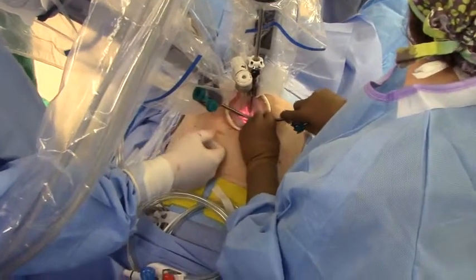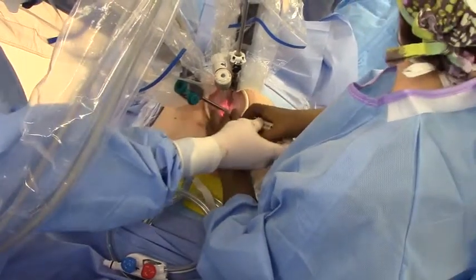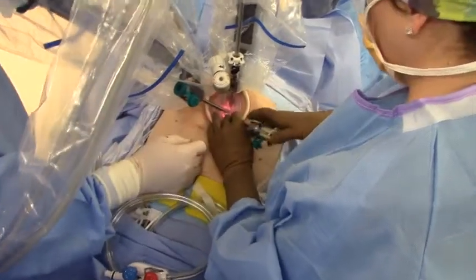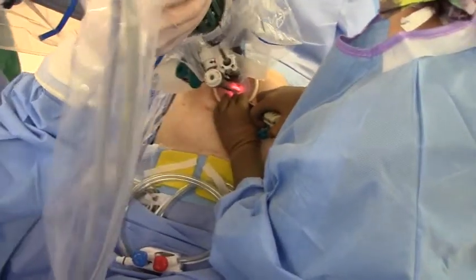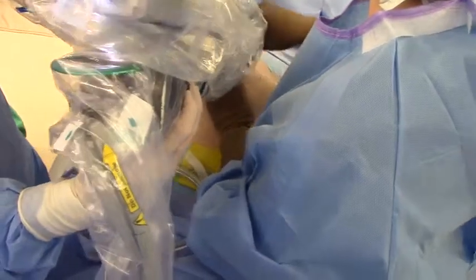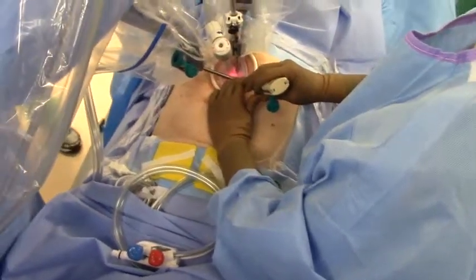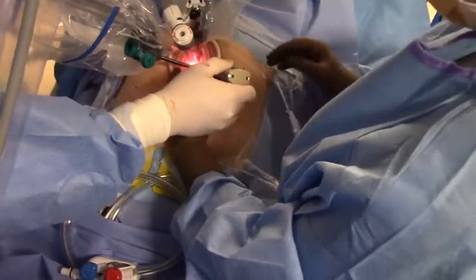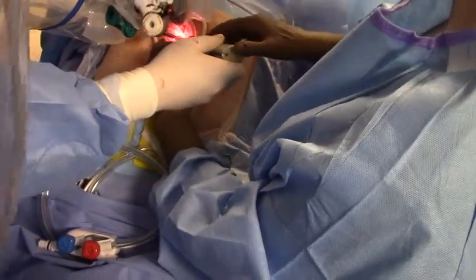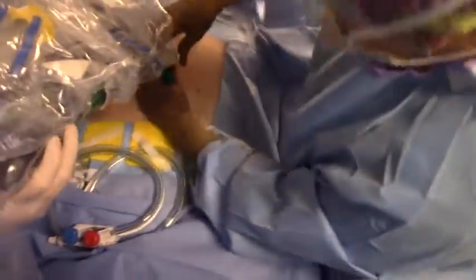Rotate — so kind of angle it, yeah. Put your hand up. I'm going to turn this up a little bit. I'm going to go through a false cord. I'm going to pull it back to where your G is. You can pull it all the way out. Put it in there. Look at you — you did a great job. That's how I usually put it in anyway.